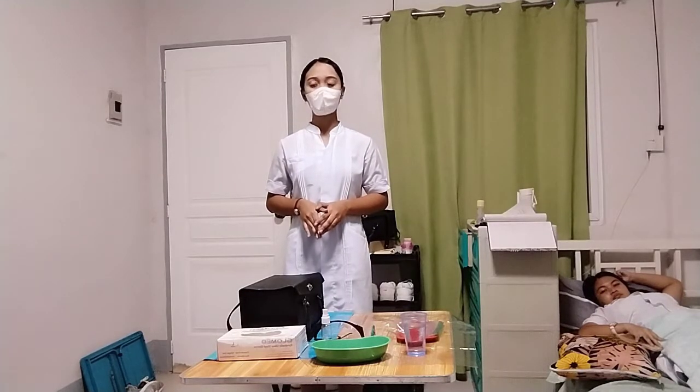So for the assessment, the points to be assessed during sputum specimen collection are: assess the overall health of the client related to the test being conducted, assess the need for the collection of the sputum, and assess the need for PPE.